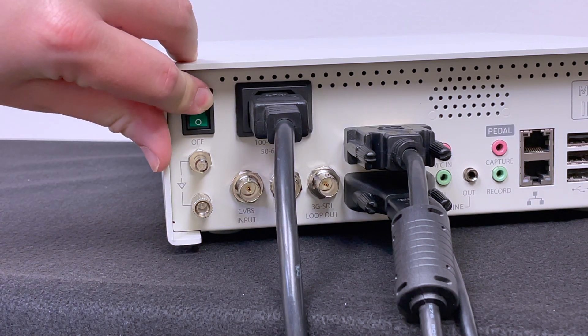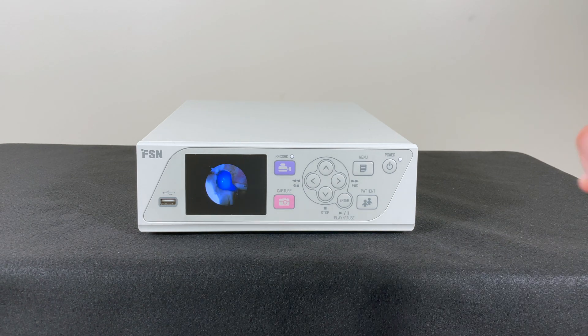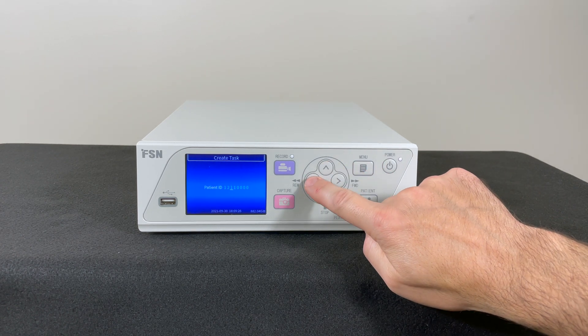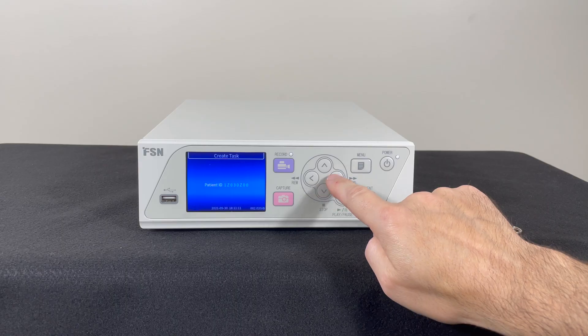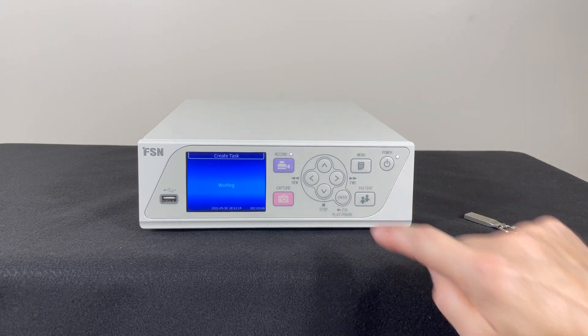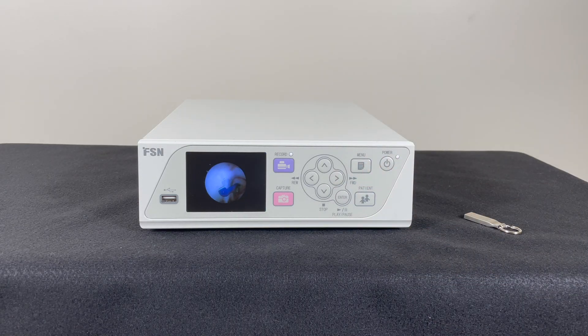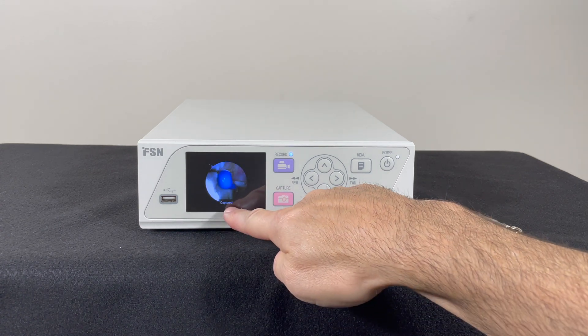Your cables are connected. Turn on the green back switch. To create a new patient and task, press the patient button and enter their ID by using the up and down buttons to change the number and the right and left buttons to move the cursor. Once the ID is complete, press enter. Press the record button, which lights up while recording. Press the capture button anytime to take pictures — the word "capture" pops up to confirm.